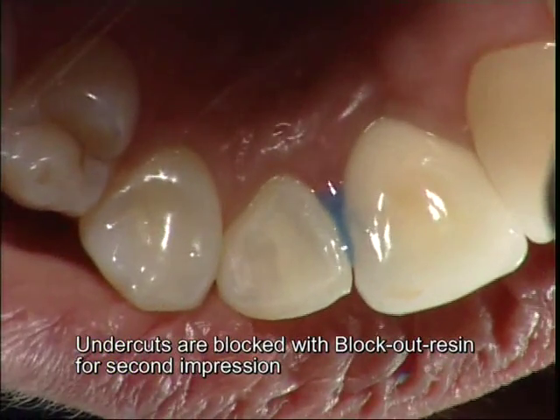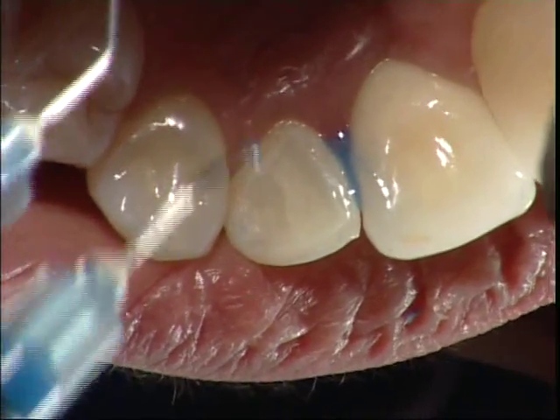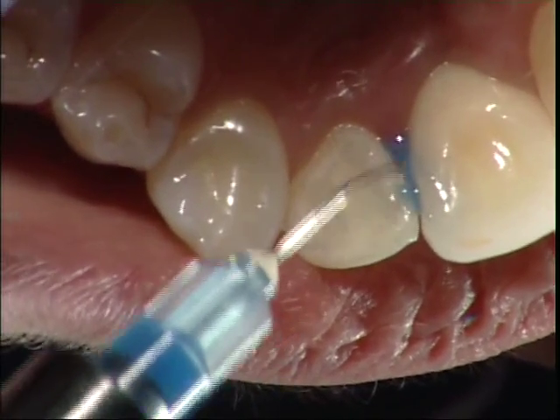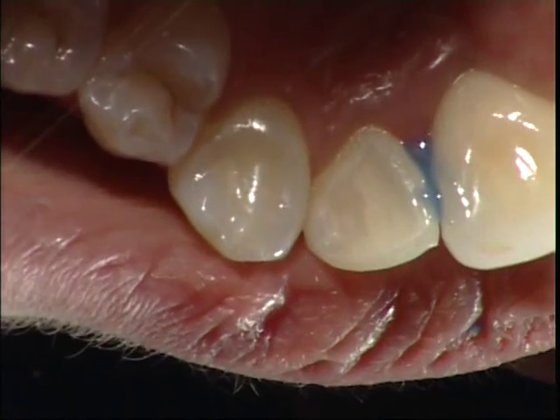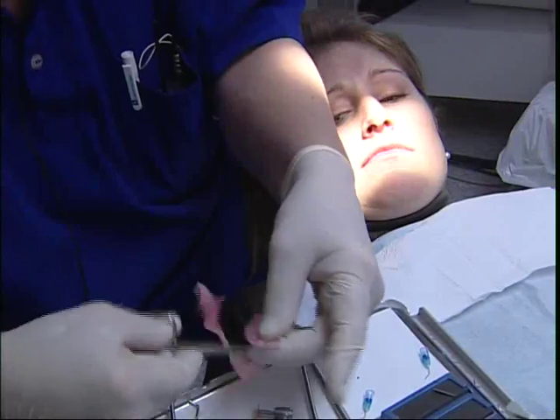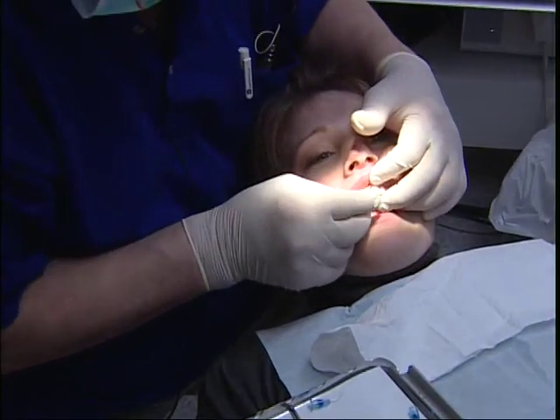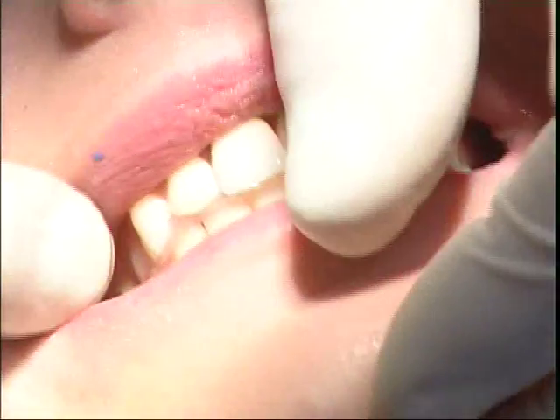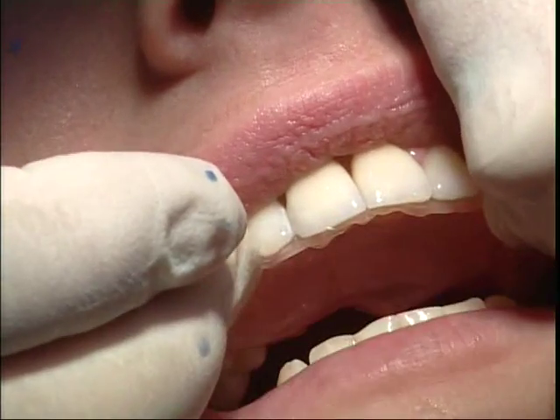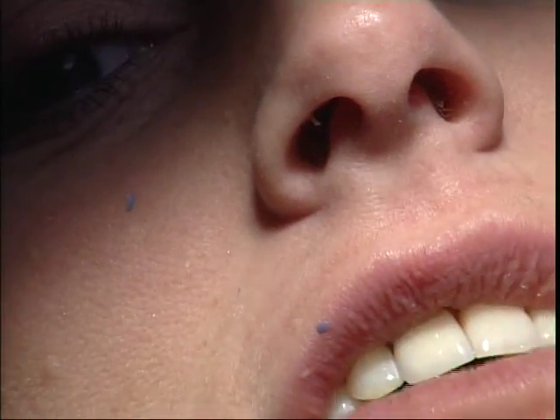This is my second impression. We take one impression with the matrix band and then we take one impression without it. To prevent the material from tearing, I will inject the block-out resin and cure that. Otherwise, the undercut area in the embrasure will make the impression tear. This is just a simple wax bite.